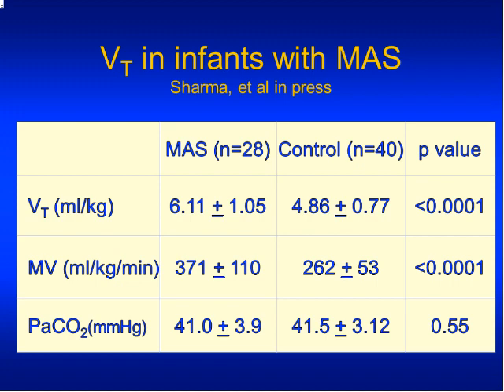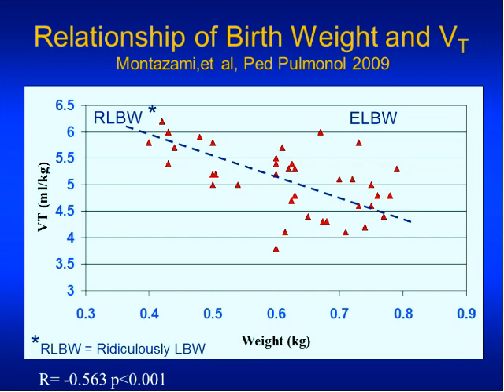They were also more tachypneic, so their total minute ventilation was quite a bit higher. But the CO2 is identical, which suggests that their alveolar minute ventilation would be the same, and this is all wasted ventilation due to the nature of the disease. So different diseases need different tidal volumes. When volume guarantee, quote unquote, doesn't work, it's almost always because we picked the wrong tidal volume.